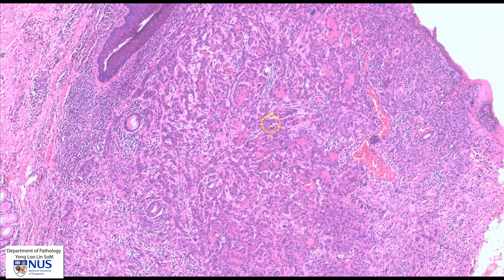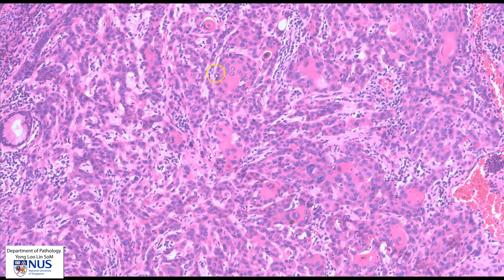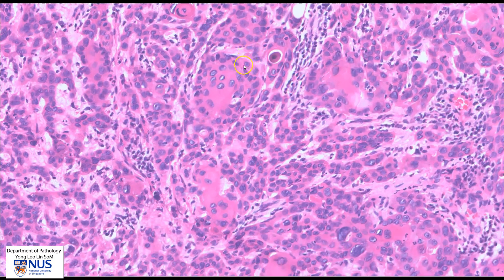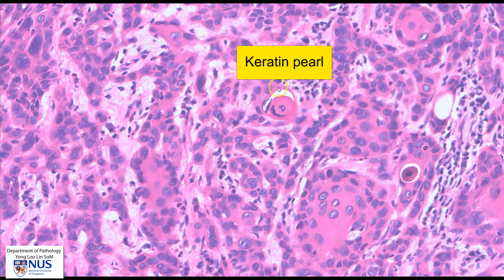So looking at this abnormal area, and this is in the supraglottic region, we can see that the tumor is composed of these irregular nests of malignant cells infiltrating into the stroma, and these cells are polygonal in shape. They have nuclei which appear to be moderately pleomorphic. These cells have very dense eosinophilic cytoplasm. We can also see some small keratin pearls forming here.